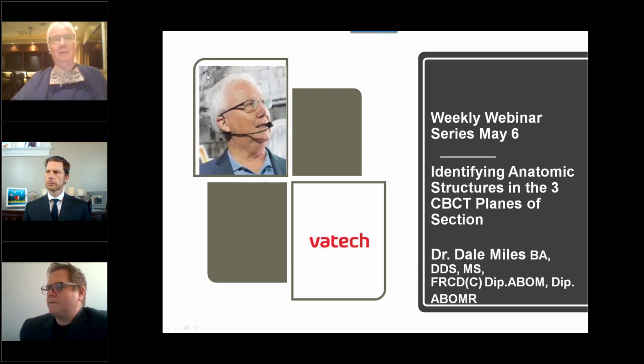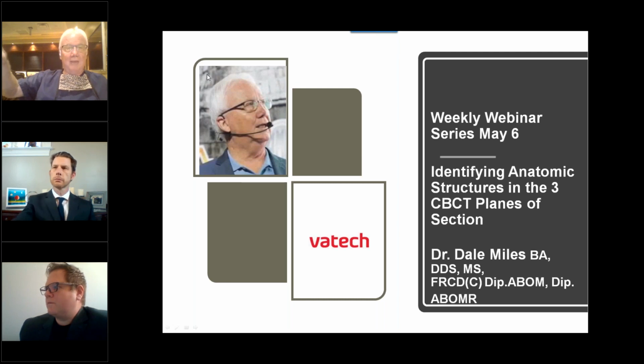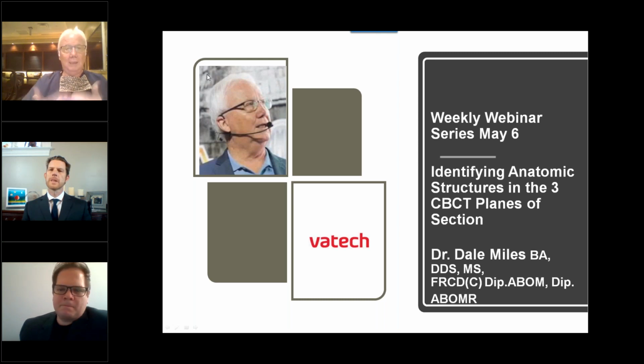If I were a medical radiologist, if I were a neuroradiologist, I guarantee you I would have one, and the ACR and the RSNA specify monitor specs that you must have in a hospital environment or radiology setting. But for our needs, because it's just high spatial resolution and filters or tools to get more clinical information out of the scan, a pretty high grade commercial monitor would be just fine.